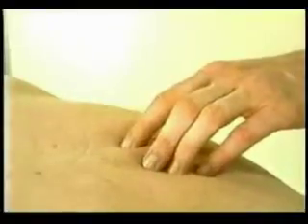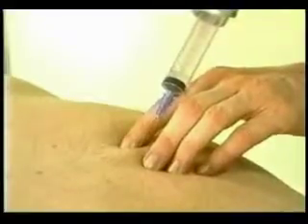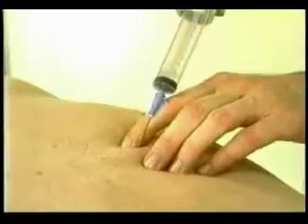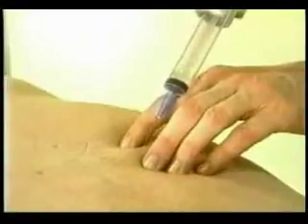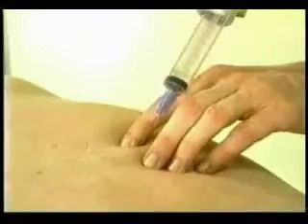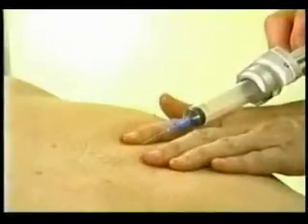One possibility is to lean the barrel of the syringe against the forefinger of the palpating hand. Make sure not to use the needle for support since this will cause contamination. In order to get a good angle for sampling, it is necessary to bend the fore and middle finger in this fashion, as opposed to keeping them flat on the patient's skin.